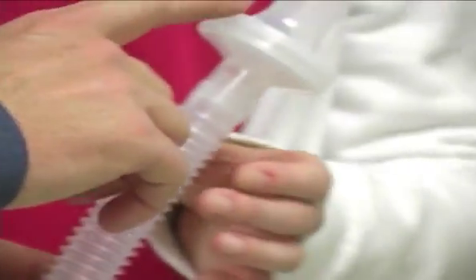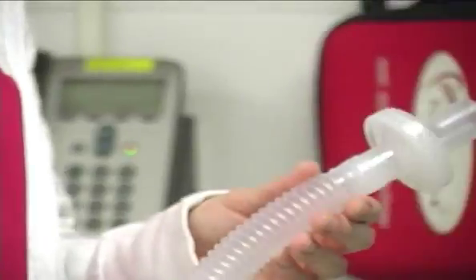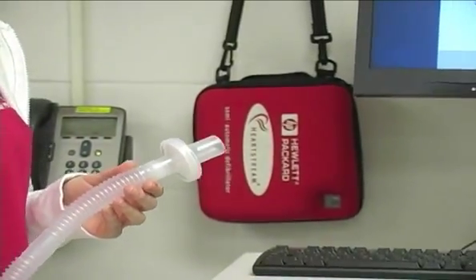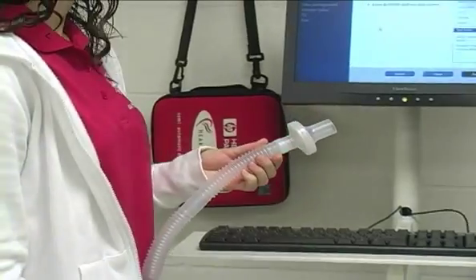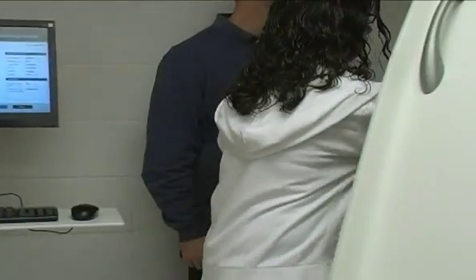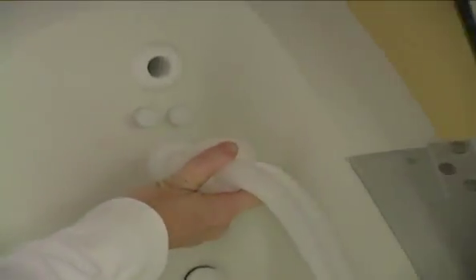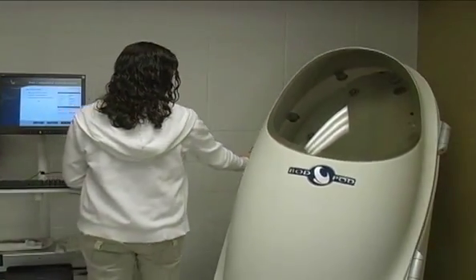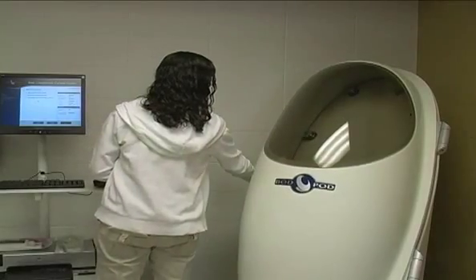What we'll do is take the large end, and see this port right here? So there's a port here. This is where Stacy's going to attach it. And again, just so it's snug. So close the door, hit next. Again, there's that process. Open next, close next.